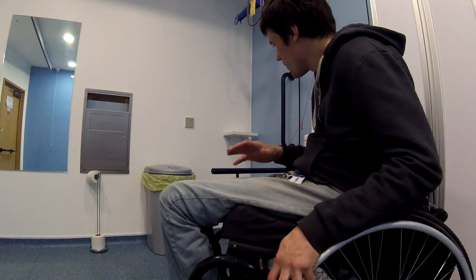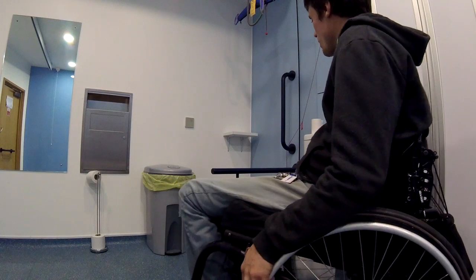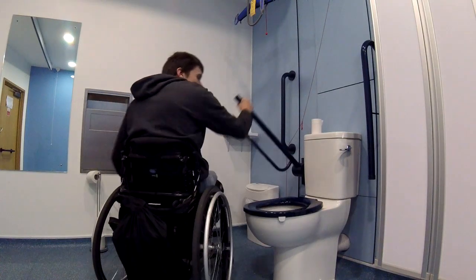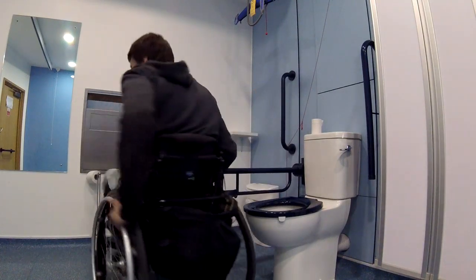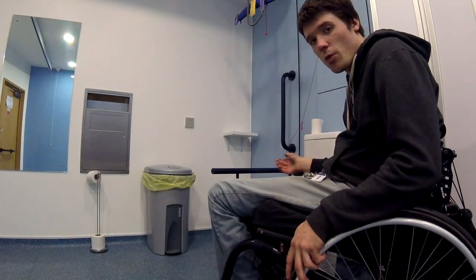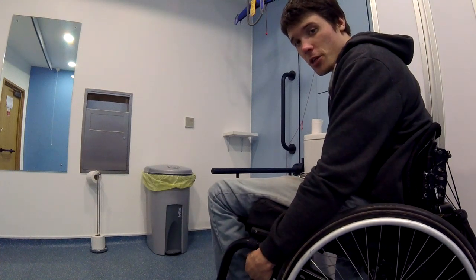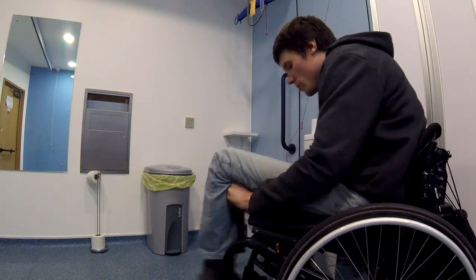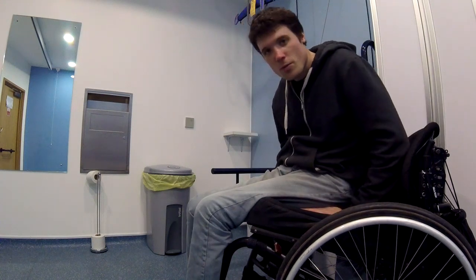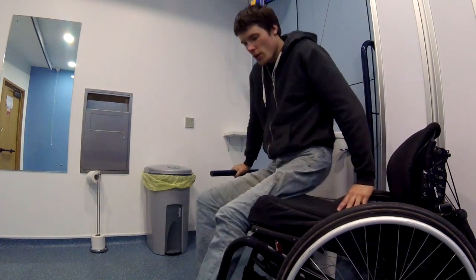This next setup is slightly different. The toilet isn't actually next to the wall, so instead of a horizontal bar attached to the wall, there is a second vertical bar. The only difference with this setup is that instead of using the wall-attached bar, you will use the second vertical bar as a substitute. Same thing again — move to the front of the seat, grab the substitute bar, lift, and twist.